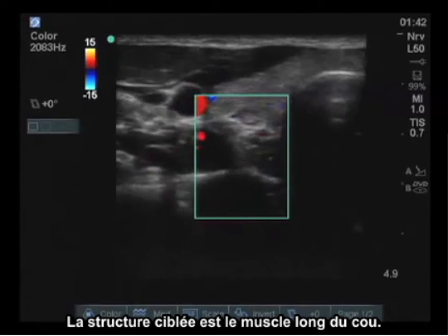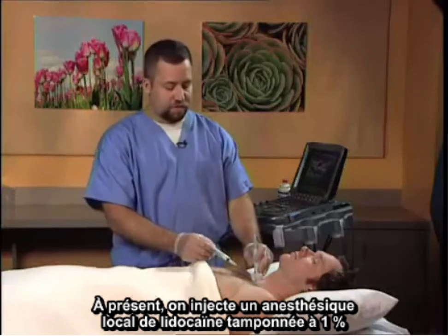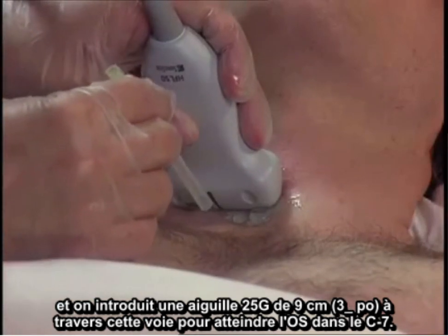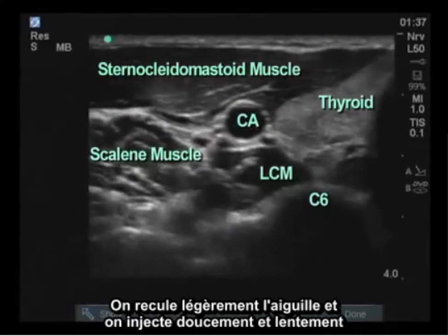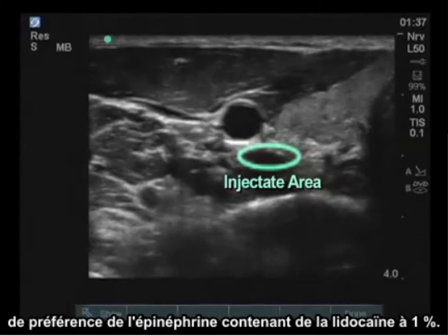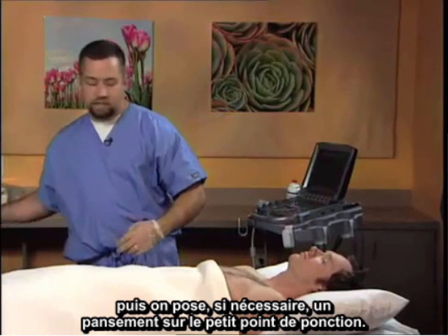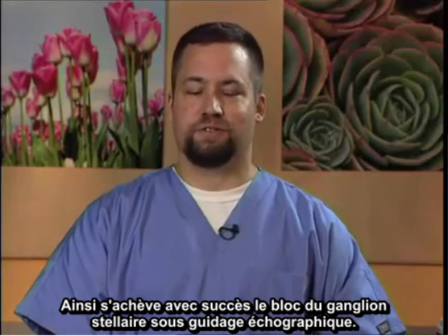The structure of interest is the longus colli muscle. Local anesthetic — 1% buffered lidocaine — is injected and a 25 gauge 3.5 inch needle is advanced through this track to contact the bone at C7. The needle is backed off slightly and then the injection of local anesthetic, preferably epinephrine-containing 1% lidocaine, 6 to 7 cc, is gently and slowly injected. At this point, the probe is removed, the skin wiped and cleaned, and if needed, a band-aid placed over the small puncture site. This successfully concludes a stellate ganglion block performed under ultrasound guidance.